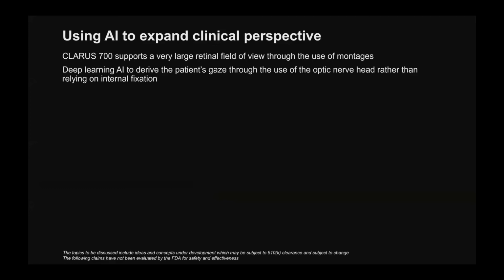Traditionally, in the older cameras, when the montage is done, the quality of the montage is very dependent on how well the subject is fixating on the fixations. If the patient is not a good fixator, we will end up having a montage which will have vessel breaks or not a good quality.